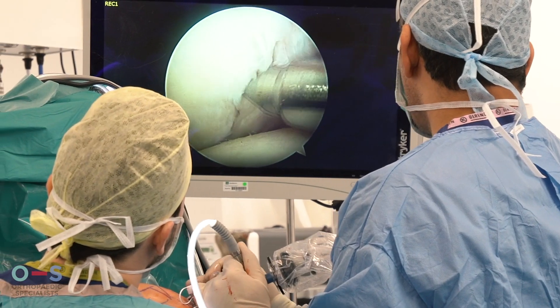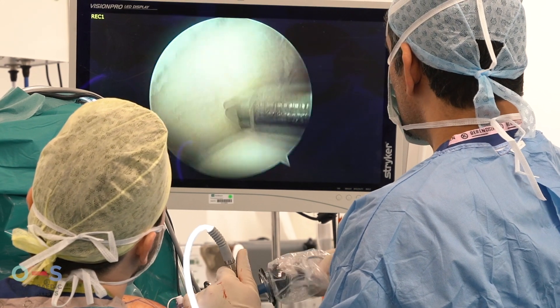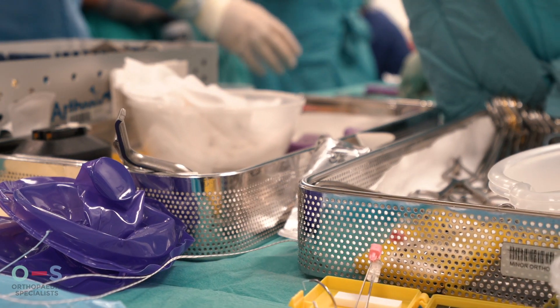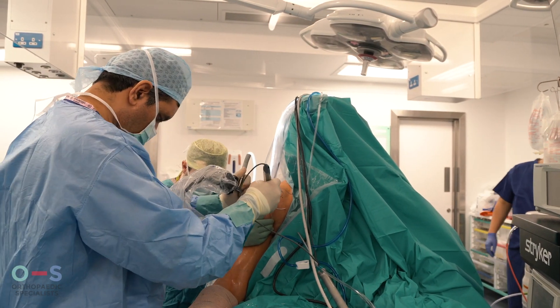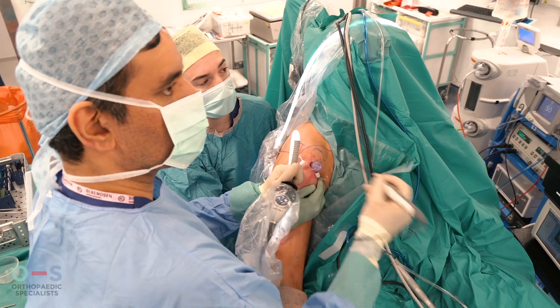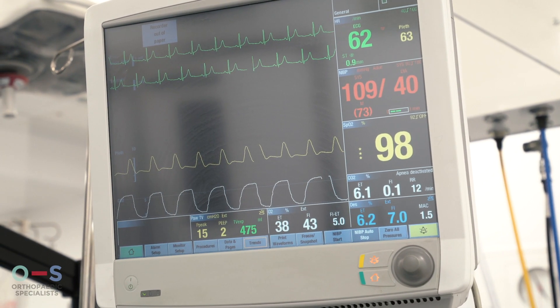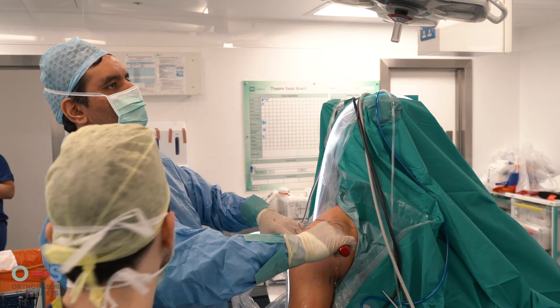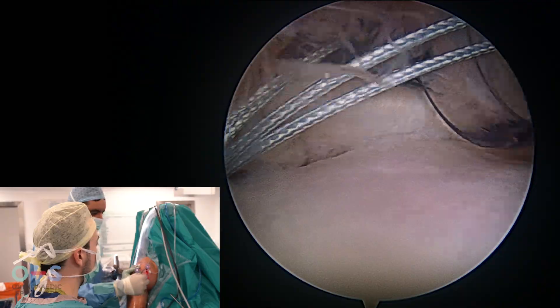This is a typical view of the inside of the shoulder that is available to me. Then we repair the damaged areas. In this case, we are repairing the damaged ligaments or the labrum of the shoulder using suture anchors.